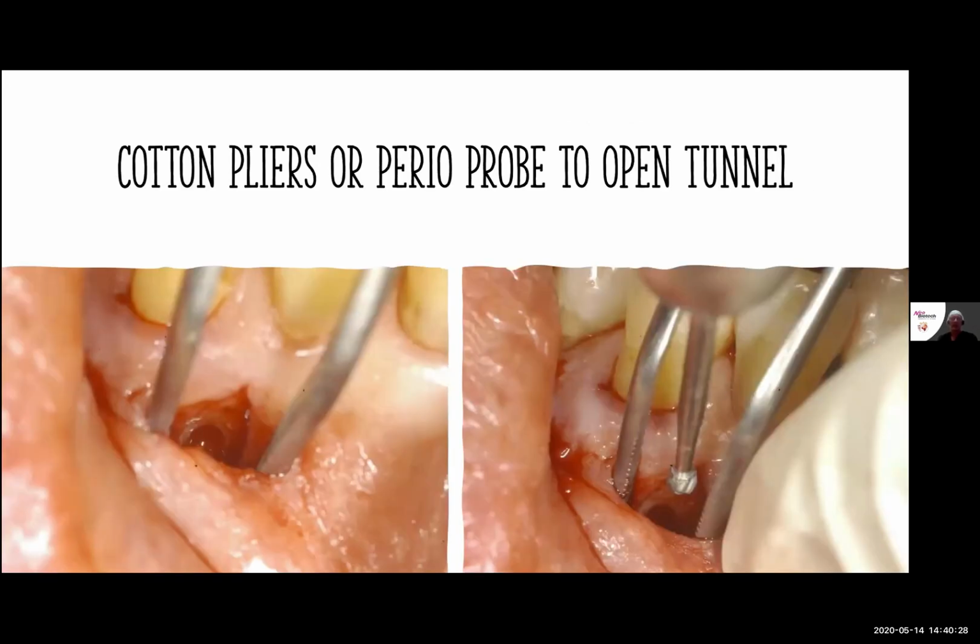And then I'm using a variety of things. One, you can use either a perio probe to lift the tunnel up or lift the graft up, or two, this is some cotton pliers. Now, don't use your best cotton pliers that you want to make sure have good serrated edges. Use the ones that you've got sitting on the side that you don't really like, that don't really hold things well. Keep those. These are great because your quarter round burr is going to hit your instrument there.